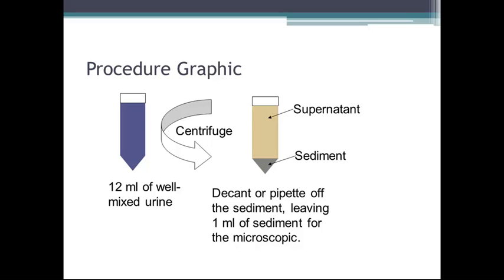First, with a urine examination, we do the physical exam first and the chemical exam after the physical exam. You want to do these two before you spin down your specimen to get the sediment at the bottom. The reason is that all the solutes and sediment would not be suspended in the urine, and the dipstick would then be inaccurate.